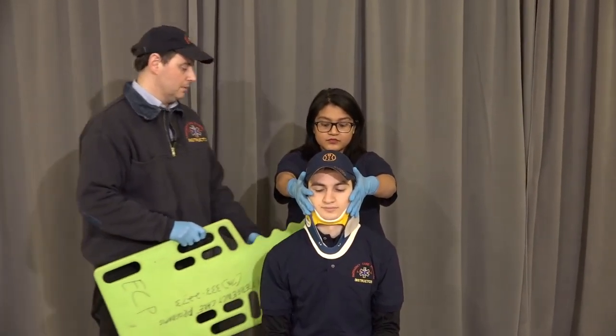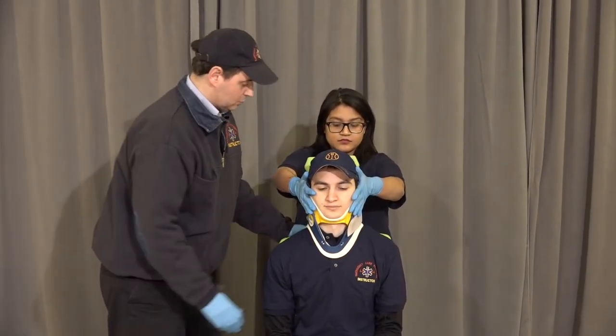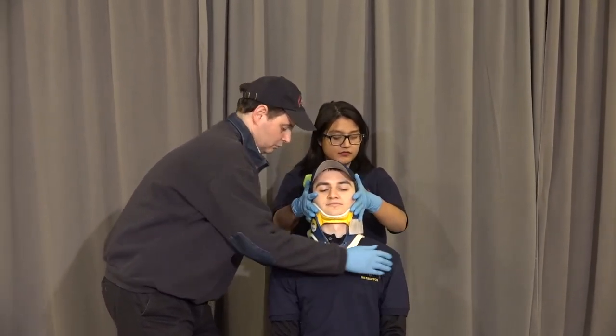Take the shortboard, pass it behind my patient, slide it down so it's in line with his shoulders. On the count of three, we're going to move them back. One, two, three. Great.